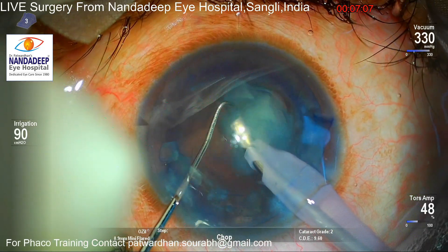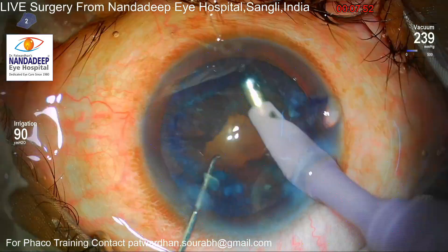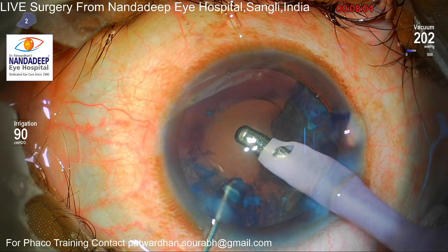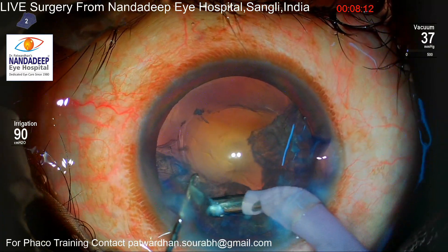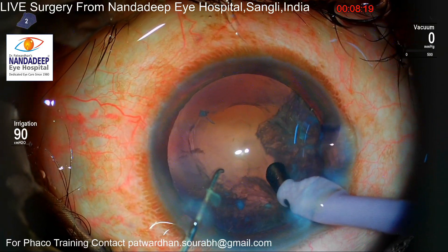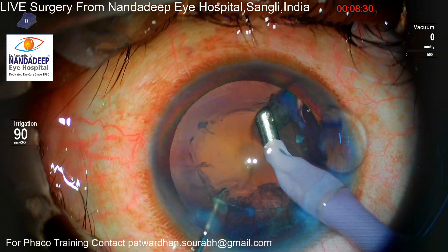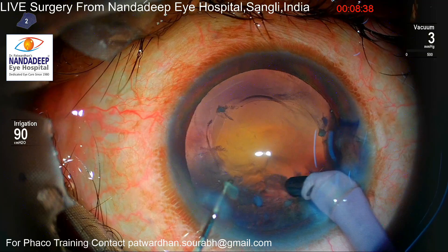You can see I'm using very minimal energy and mostly it is aspiration which is working. As I move around and take out all the pieces, I notice there is a little amount of fluid which has gone into Burgers space, and that has started pushing the posterior capsule anteriorly. So while doing cortex aspiration I am very careful — watching for capsular movement or bag movement, because sometimes after removal of the nucleus the bag might crumple in areas where zonules are weak.